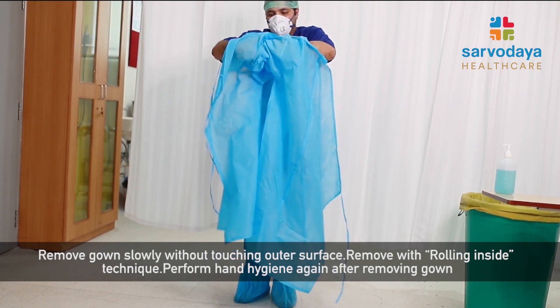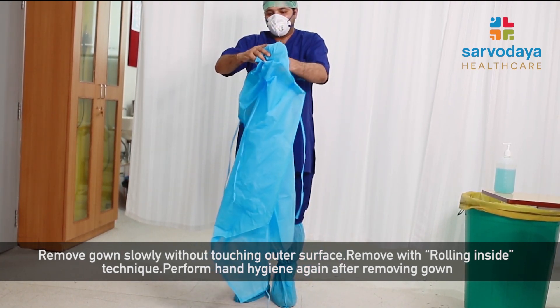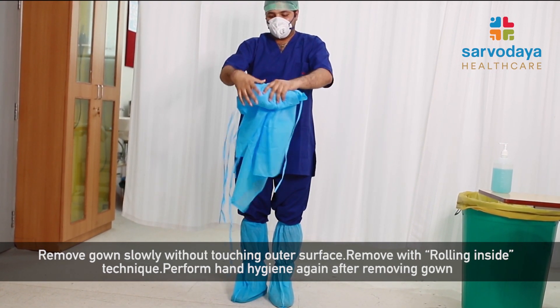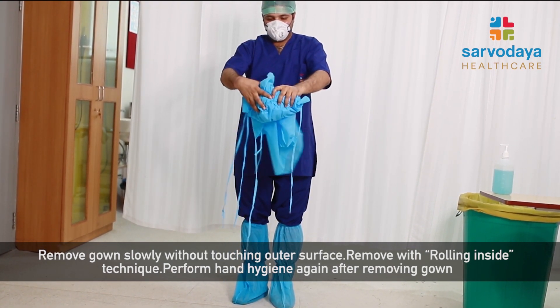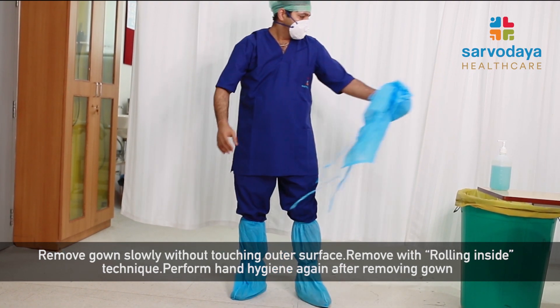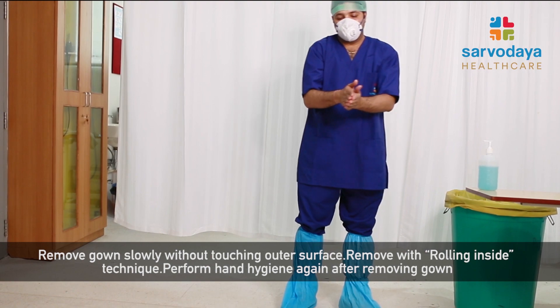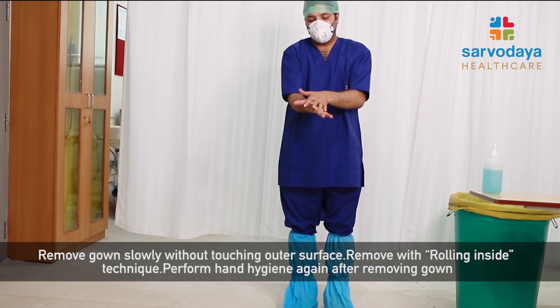While doing so, make the gown into a small ball with the inner surface out and discard it in the bin. Once we do that, we perform hand hygiene again.